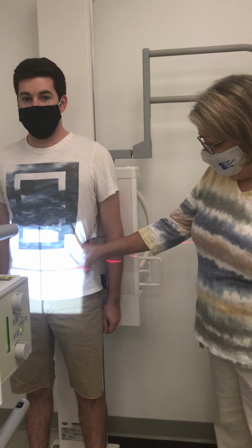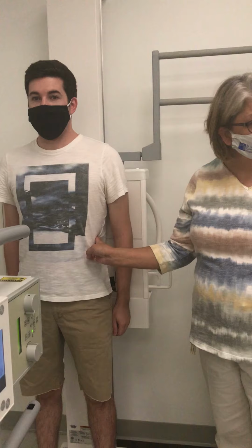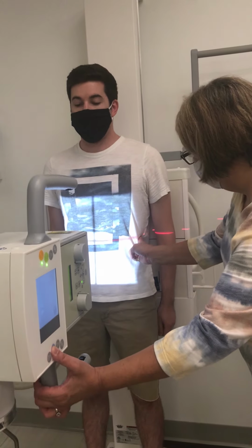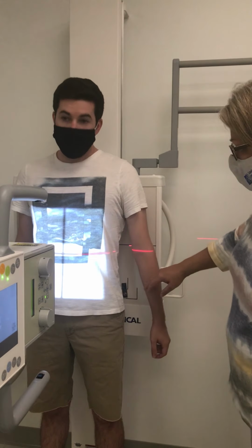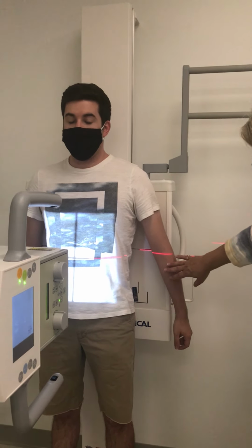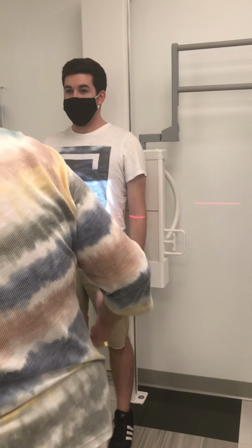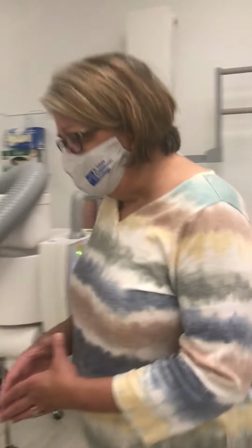So I found the iliac crest, and I put 3 fingers above that iliac crest, which for me I know is 2 inches. So I'm going to raise my tube and center 2 inches above the iliac crest. Make sure I align my central ray to my image receptor. And then, sir, you get arms slightly away from your side. I want to center in at the mid-sagittal plane, which I am. Again, no shielding is necessary. I'm going to give you some breathing instructions.